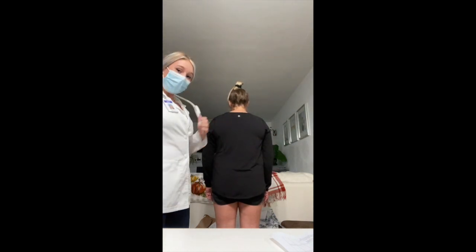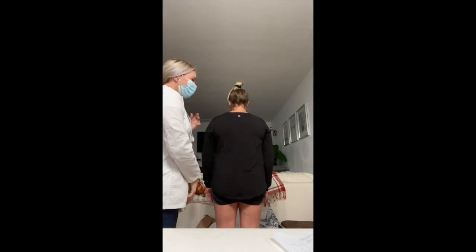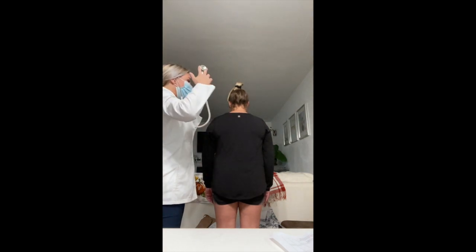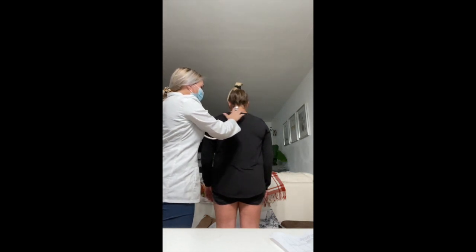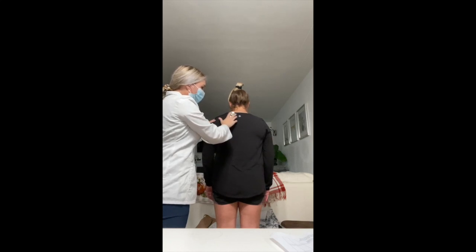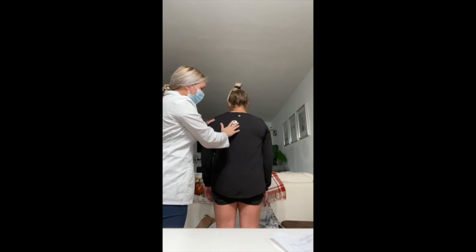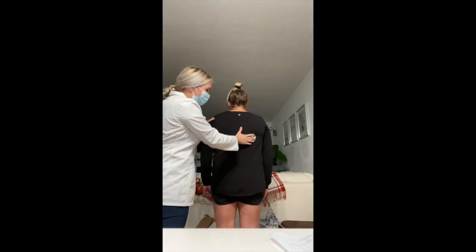So now I'm going to assess in 6 spots. So when you feel my stethoscope, you're going to take a deep breath in through an open mouth and then out with pursed lips. Between the shoulder blades, not on. And then I'm doing the bases of the lungs. This is underneath the shoulder blades.